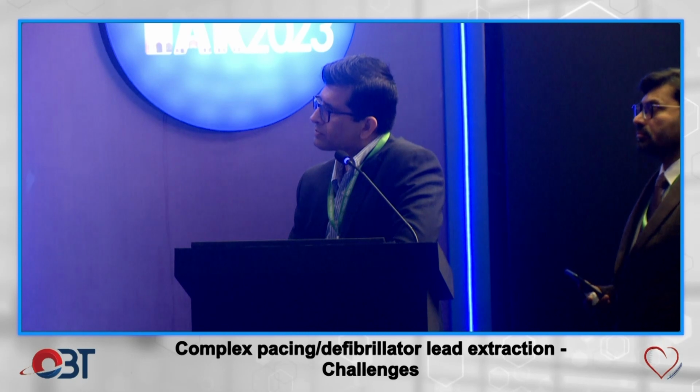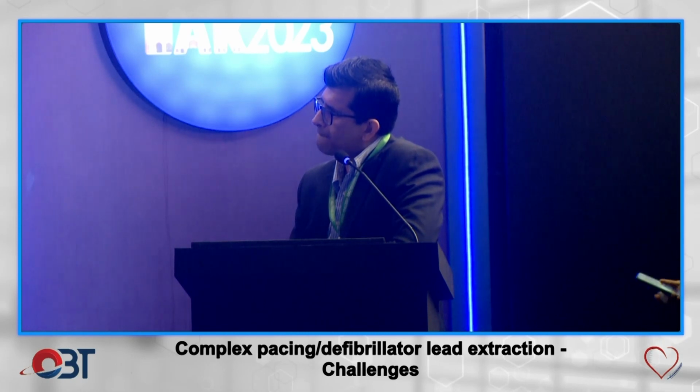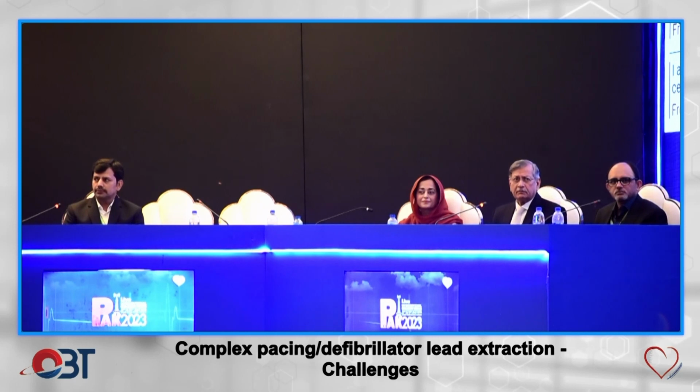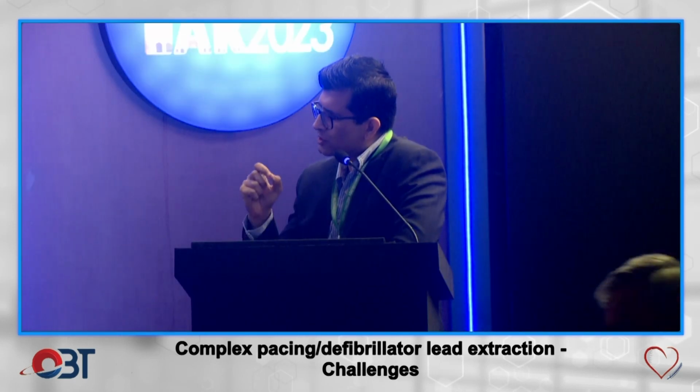So what's the incidence of RV puncture? Because in coronaries in those days, it was not so well controlled. The puncture was reasonably common. So how precise is this one? Sir, once again, what's the depth of the laser ray? Sir, the depth is in micrometers. It is very minimal.